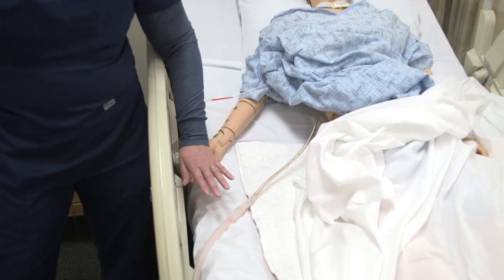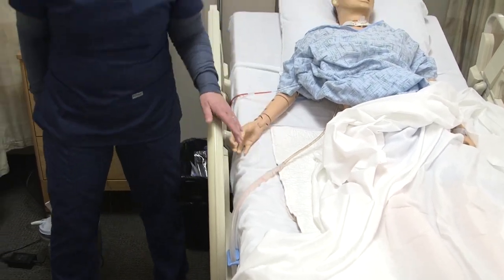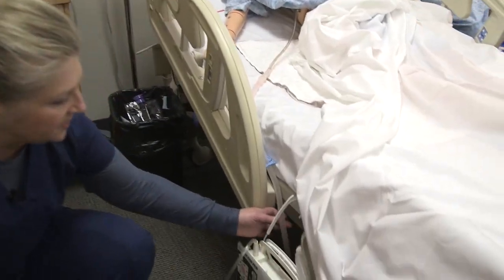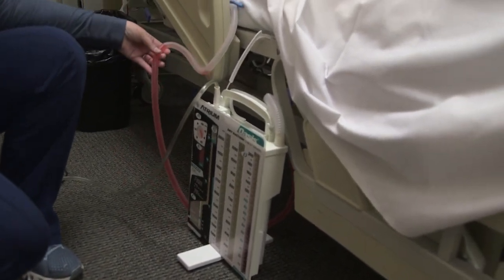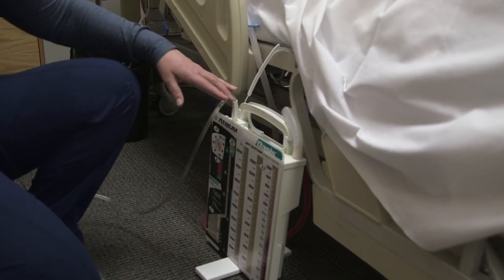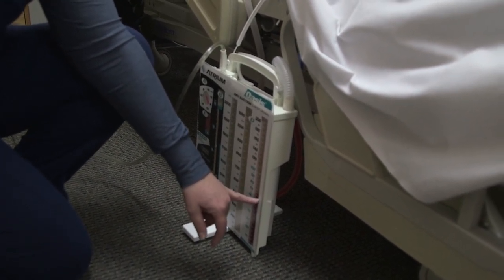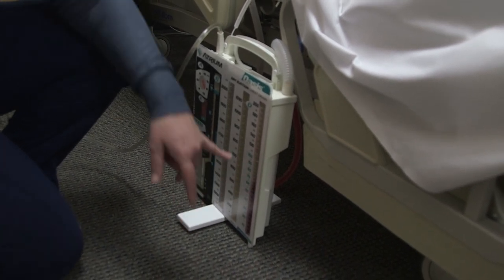Another important thing to look for is making sure there are no kinks within this system — if it kinks off, you won't have adequate functioning of the system. With this particular patient, they are draining; it's most likely a hemothorax because they're draining blood into the system. As a nurse, you're going to be monitoring this every shift and noting at the end of your shift the level of drainage collected in the drainage chamber.